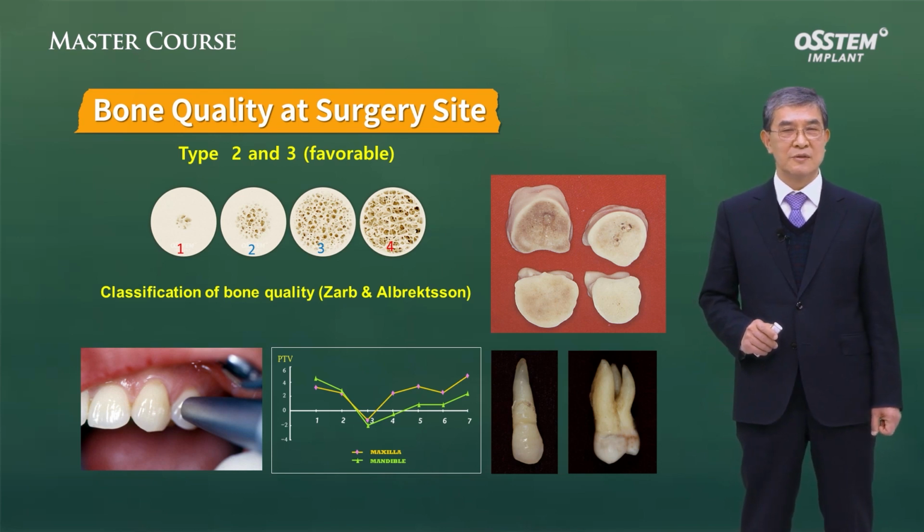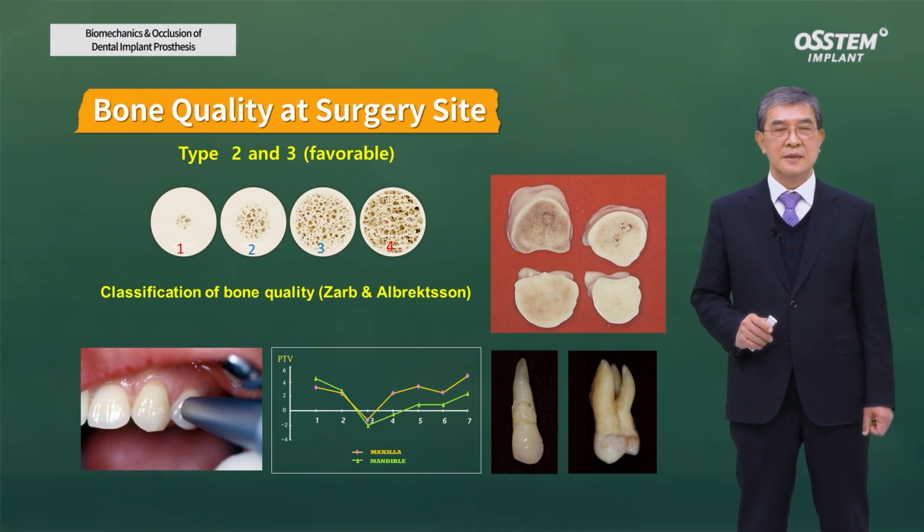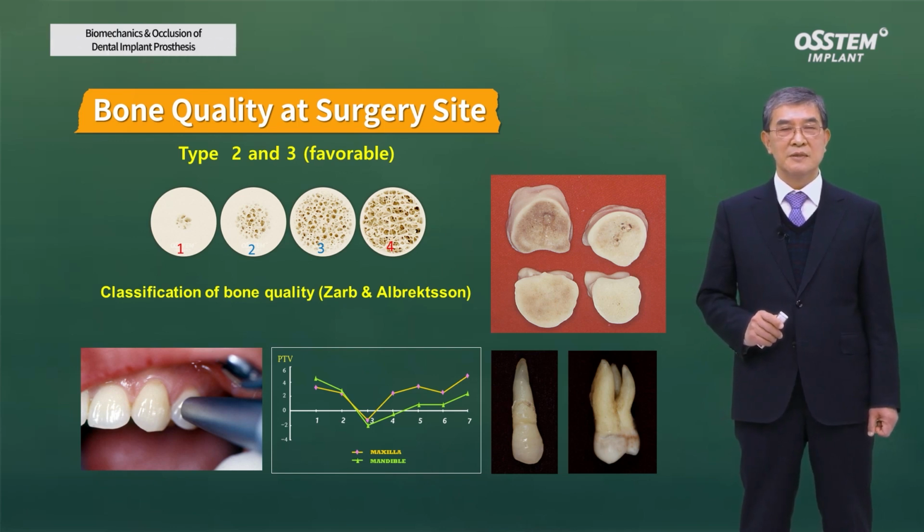The image below is when I had done a stability test using Periotest on my students when I was teaching in college. The test was done from central incisor to second molar and on students with natural teeth instead of ones with bridges.